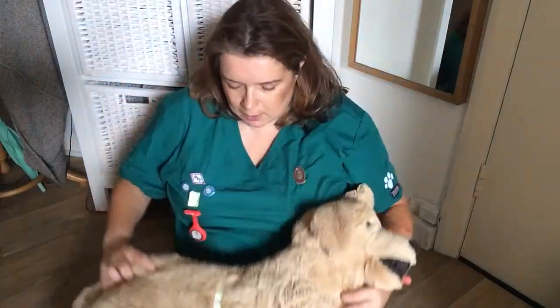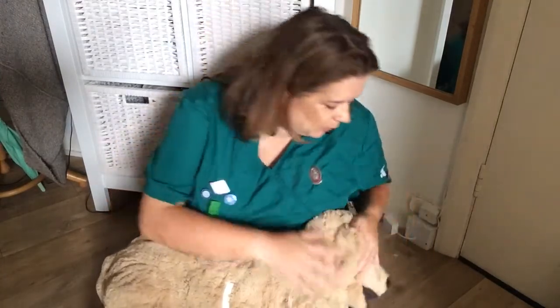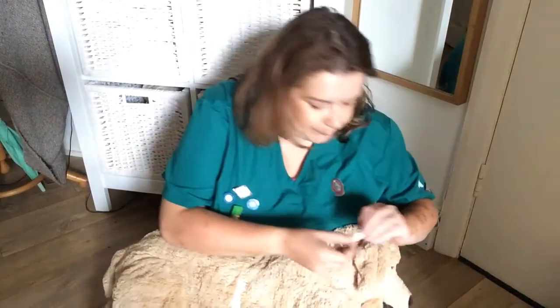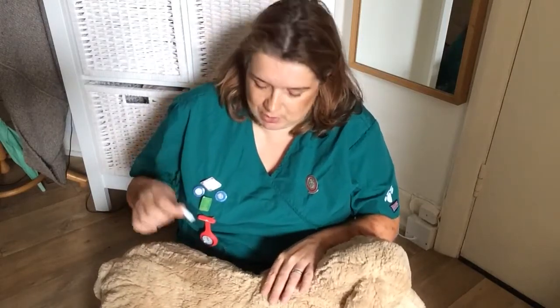We've got it all sorted there. What this gives me — you can all of a sudden see — if I bring this to the top, we have got a thoracolumbar junction because we've got a thoracic spine and our lumbar spine. Let's get another one. And although this isn't technically for our thorax x-rays, it's going to help us if we're thinking about where we're potentially going to do our spinal x-rays. I'm going to stick that on the top.